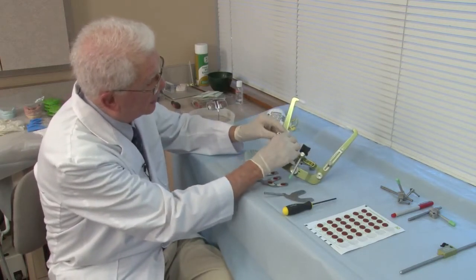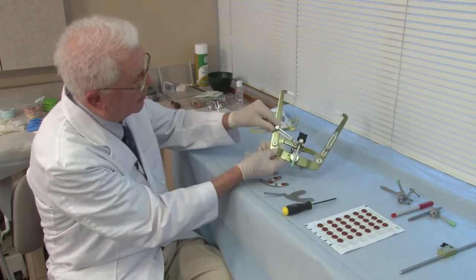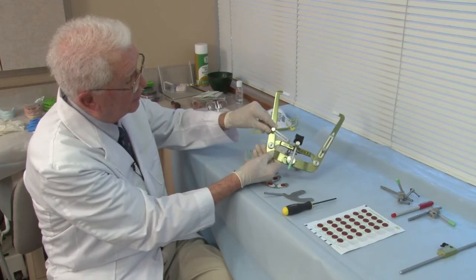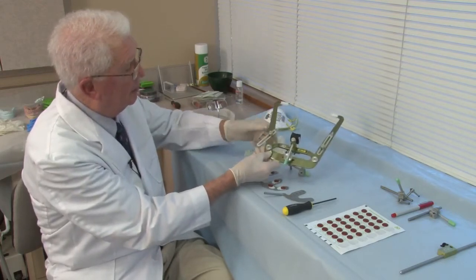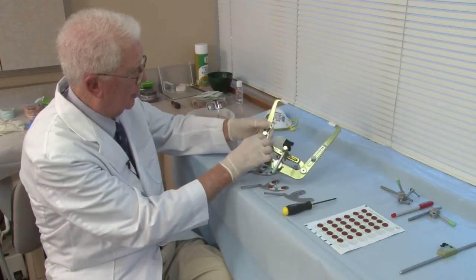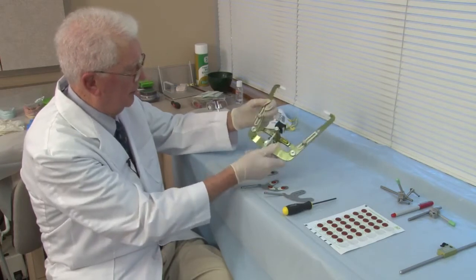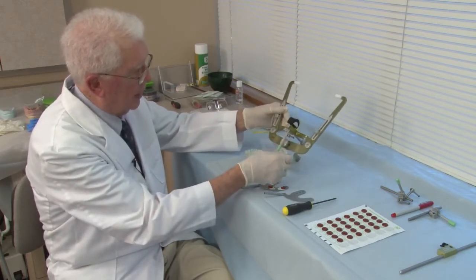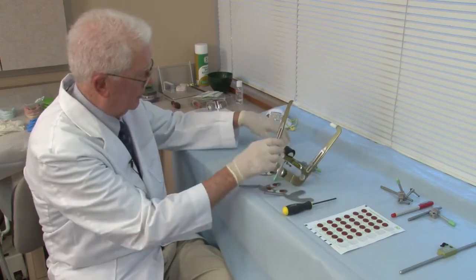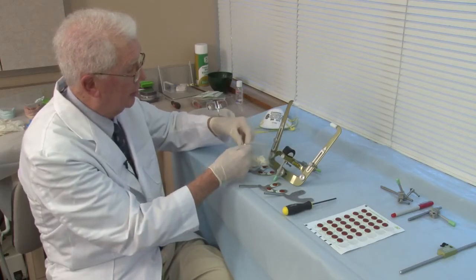Let me get it in the right position. See, the pointer comes out exactly at the same level as the vertical part of the bite fork assembly. So that establishes the third reference point, and this orbital pointer here. So our bite fork now, or our estimated face bow, is ready, except for putting on the finger cots.